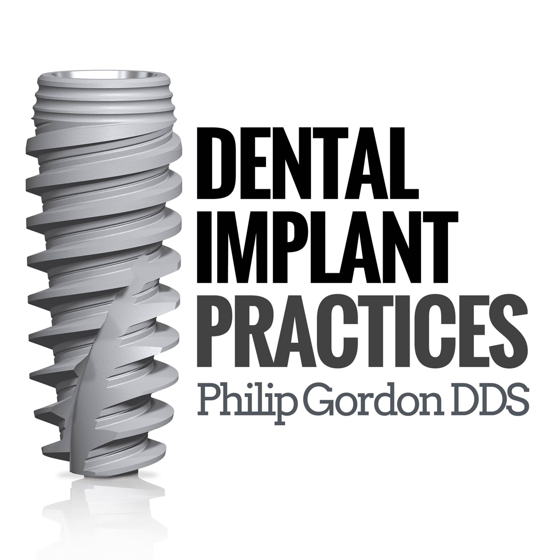So as you know, those were one-piece implants, immediate loaded, and we prepared an abutment tooth. So we made instantly a temporary fixed provisional bridge. So this went along fine. I didn't sleep the night before. I went over this a million times in my mind, the incision, the groove, and we scheduled from 1 o'clock to 5 o'clock for this appointment. And we were done at 3:30.